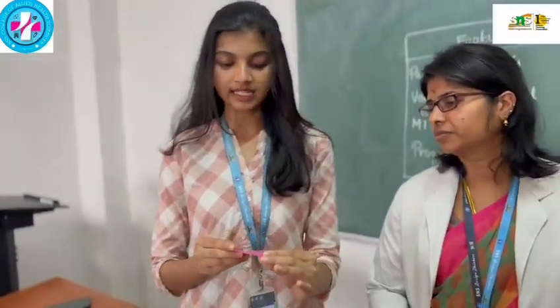So I will be explaining about the incomplete left bundle branch block. Here the QRS duration will be somewhere between 100 to 119 milliseconds, and it is less common than incomplete right bundle branch block. It is rare, and it may also progress to complete left bundle branch block.